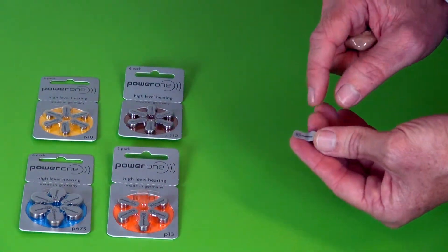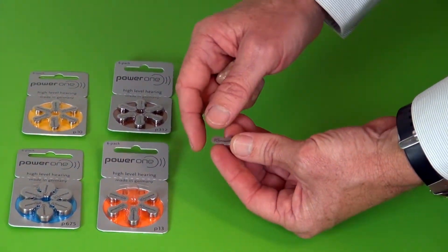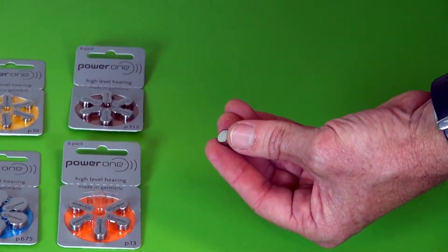To activate your battery you need to peel the sticker off the battery. That will turn it on.